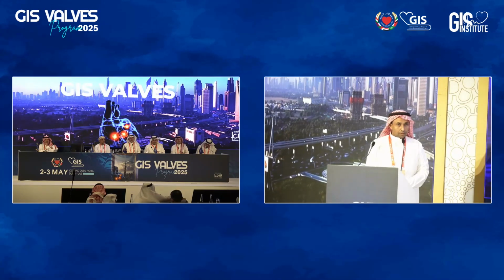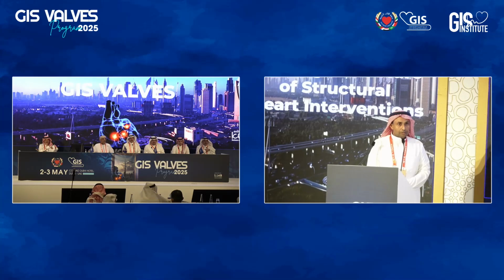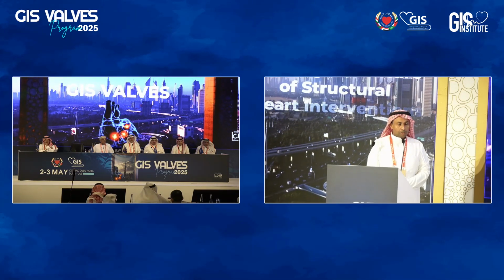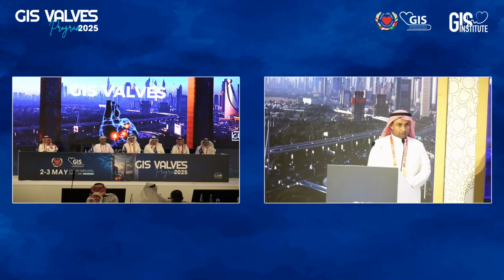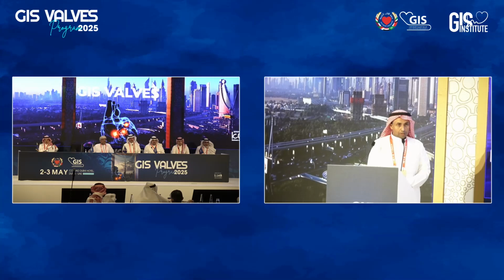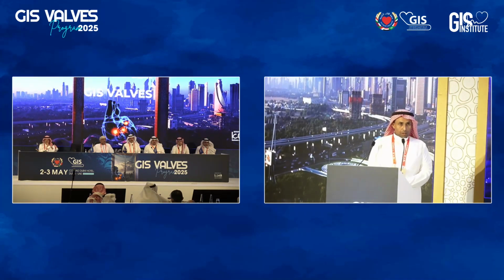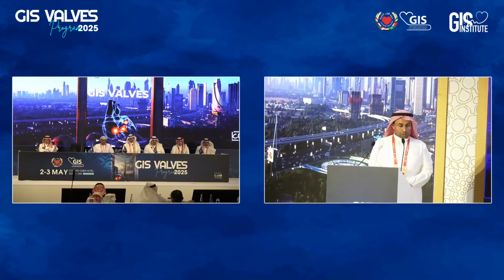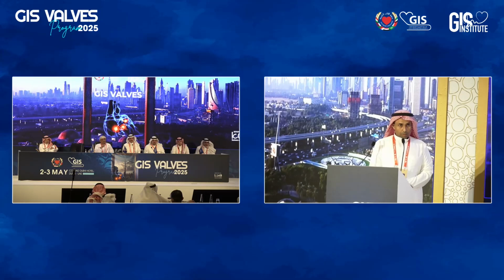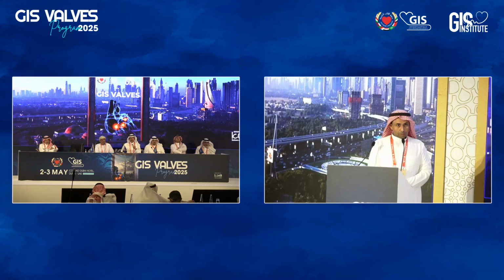Just a comment on the direction of that MR. The MR direction is posterior. Sure, it's either a restricted posterior leaflet or a prolapsed anterior leaflet. A perforation would not give that direction. I'm not sure, and if it was a perforation, then the correction would be patching, not putting a ring. So I think it's probably one of the chordae just popped off when this was inflated, and that caused it. That's just an observation.